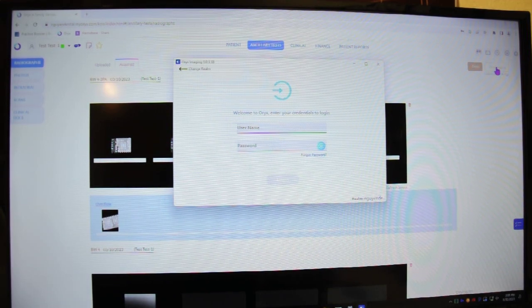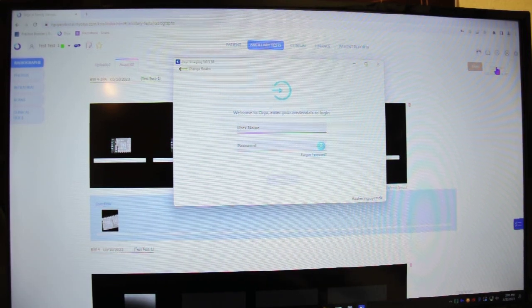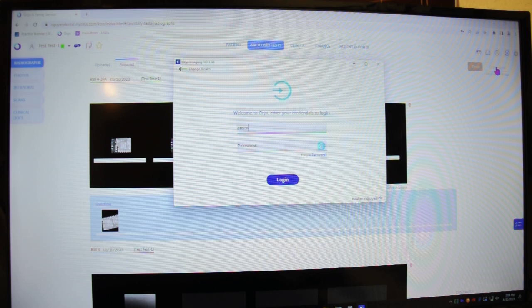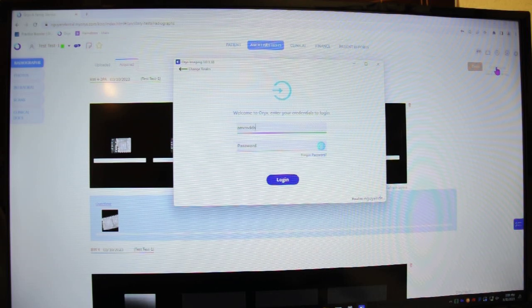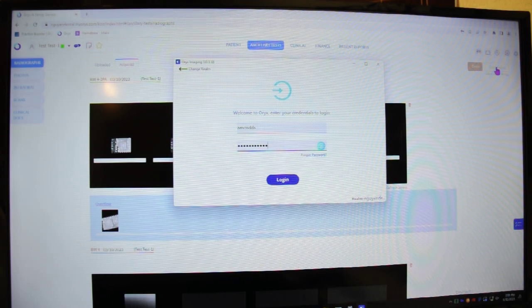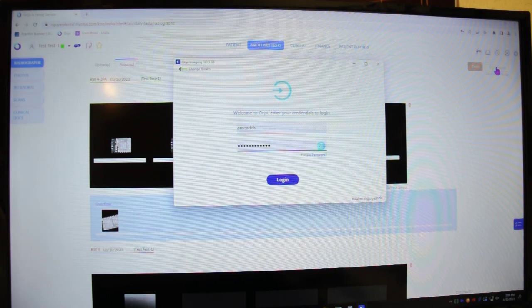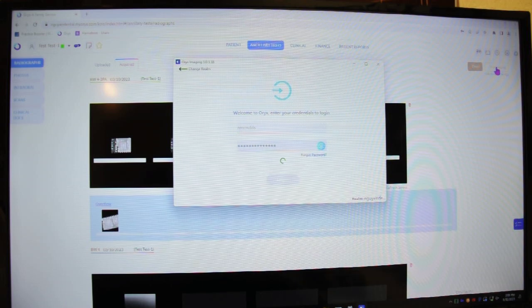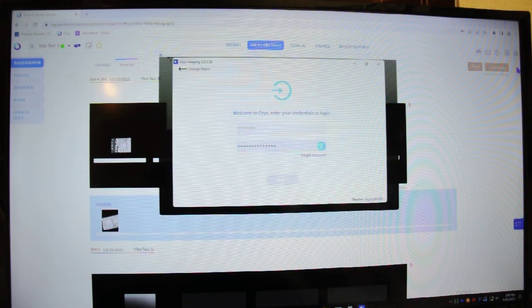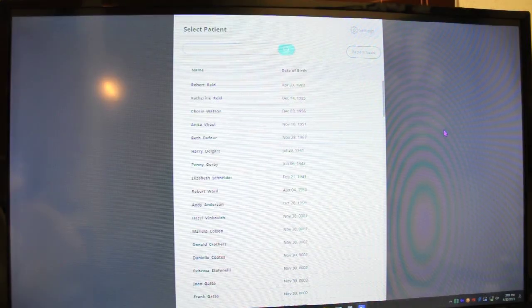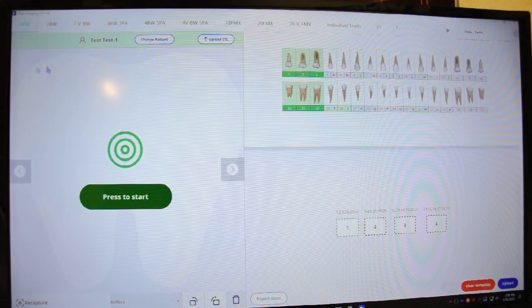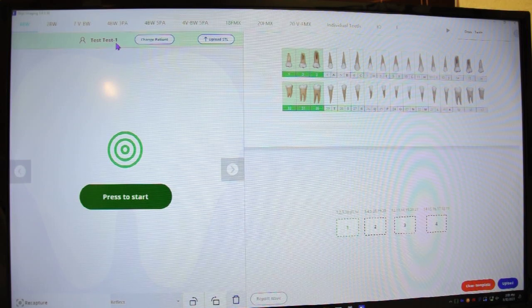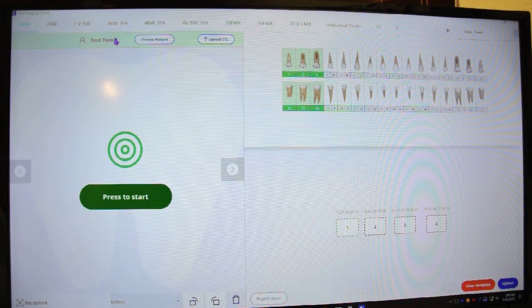Okay, so when logging in, you use the same credentials that you have to log into Oryx. With that load, it's going to select the patient that we had selected in the Oryx chart.